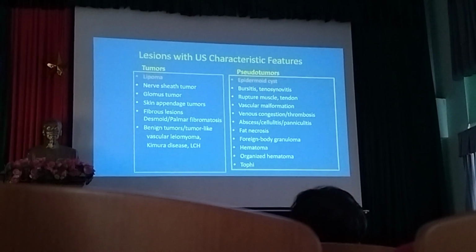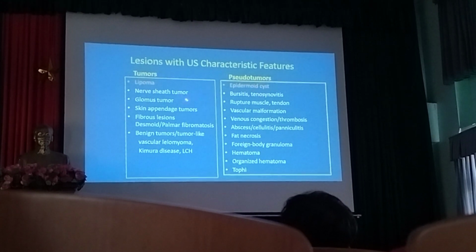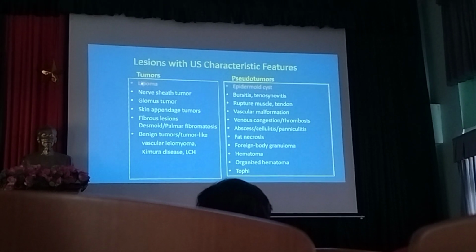Okay, and I want to show this as ultrasound can tell you whether it's tumor or pseudo tumor. There's a list of them, but I don't want you to remember all this. But I would say that there's two things.